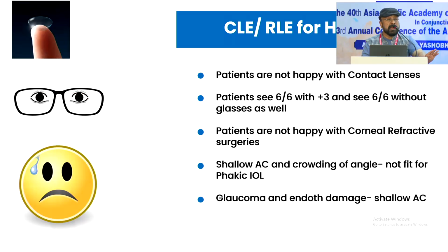And mind you, in hypermetropic cases, the patients are not happy with the glasses. Somebody prescribes +4, somebody prescribes +1. The patients using contact lenses for hypermetropia are also not very happy. But if you remove the lens and put in the intraocular lens, the patient is very happy.